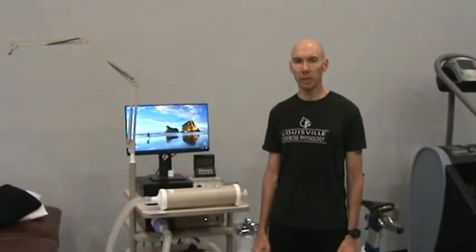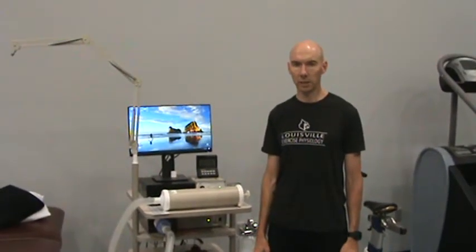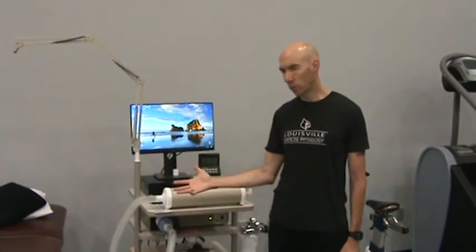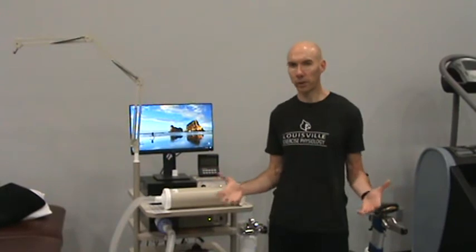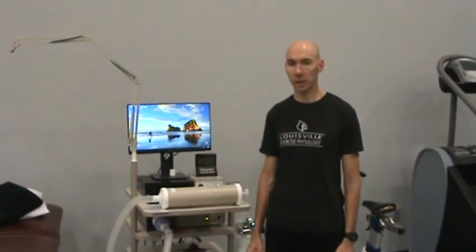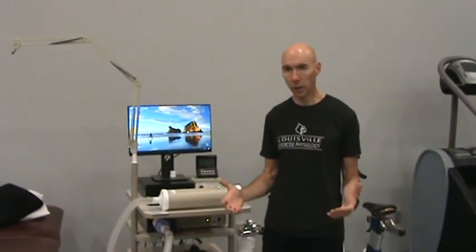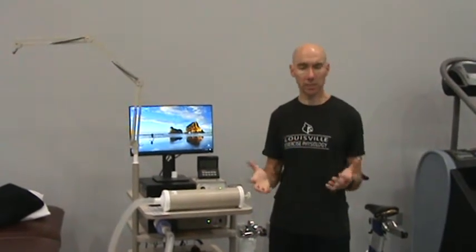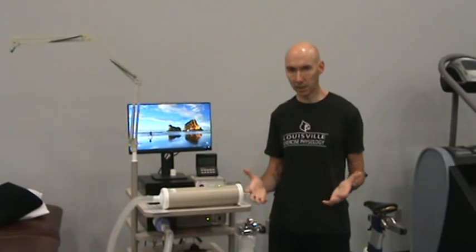Hello, this is Lab 3, resting metabolic rate. So today we have a subject who we are going to place on the exam table and take about 20 to 30 minutes to measure his resting metabolic rate. Before we do that though, we're going to go through a full calibration of the metabolic cart and talk about some of the differences between resting and exercise.